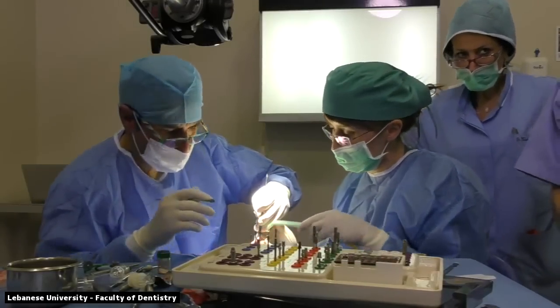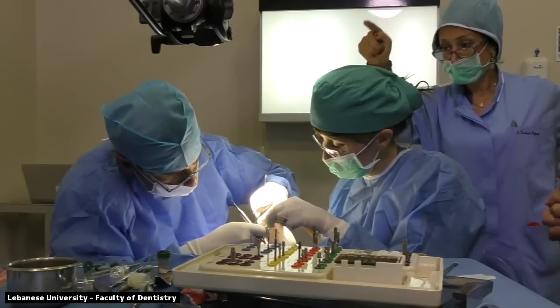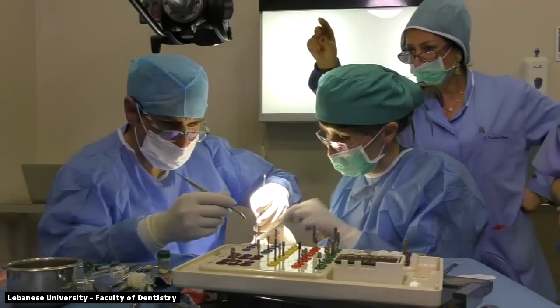Reflection with the blunt end of the periosteal elevator to expose the area between the implants and the buccal plate of bone.